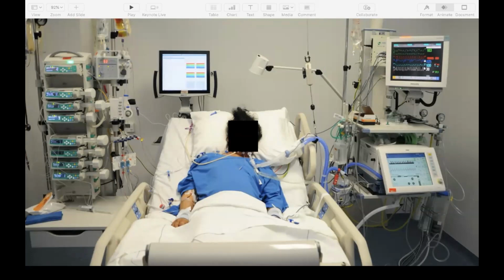Now, this is how this looks in our ICU, in our previous ICU. The patient is admitted to the intensive care unit and typically treated with mild therapeutic hypothermia, because fever is probably detrimental in these patients, so we try to prevent that. And so most patients are sedated. We prevent fever for about 24 to 48 hours after cardiac arrest, and then we taper the sedation and hope that the patient regains consciousness. But for about 5 to 8 years, we monitor this process with a very early EEG.